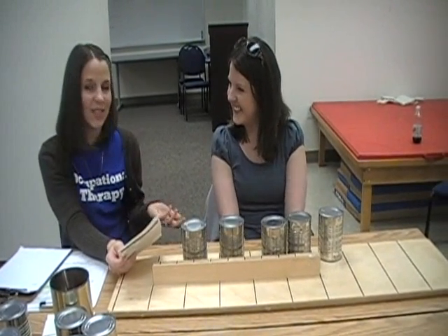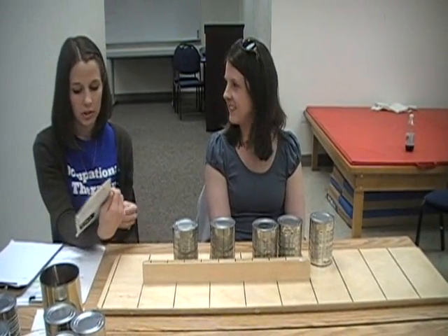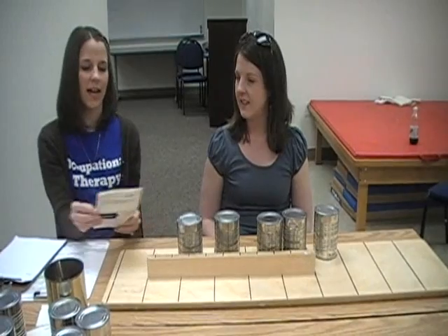Then you would get them to do the exact same thing with their dominant hand. For all these trials, you're just timing how fast they can complete the activity. Thank you very much for joining us today.